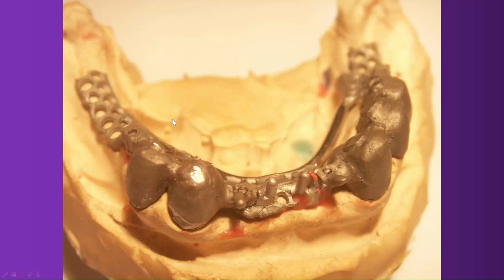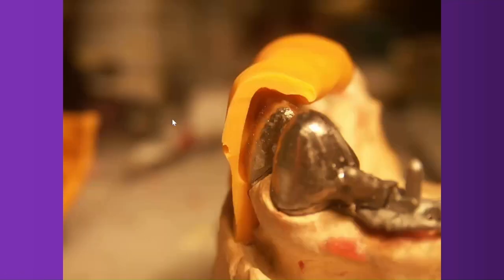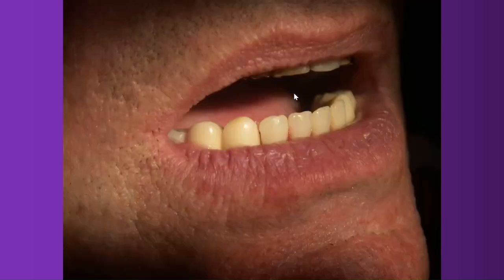In this image, you see the adaptation, mobile and fixed part. The space remained for the ceramic. Yeah, ceramic would have to be placed there. The silicon index that we got from the diagnostic wax-up of the denture. We did it, of course, because we wanted to know how much space we needed. That's history.